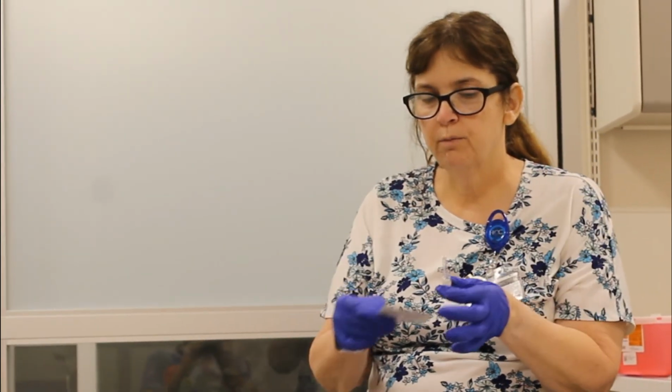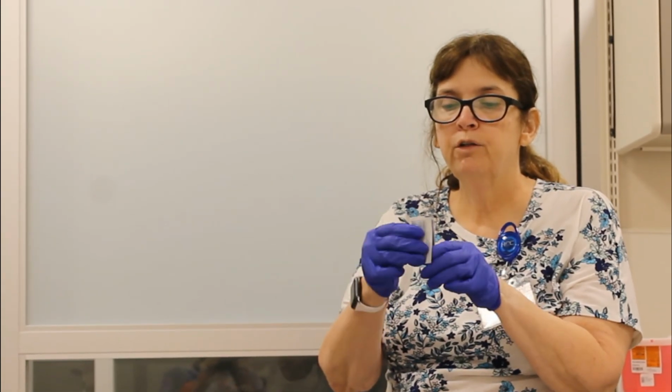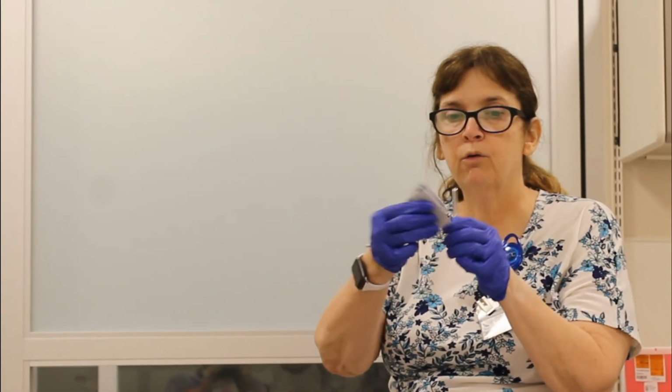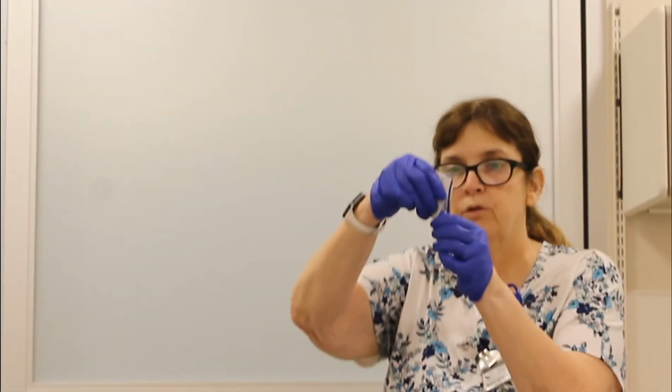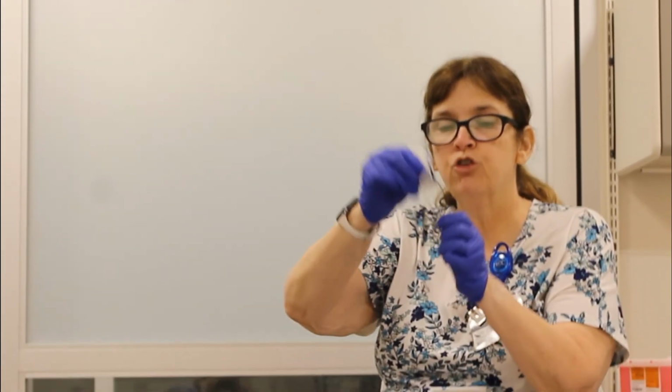All right, this medication that I'm going to show you is drawn out from an ampule. The reason I'm showing you this isn't related to our hyperkalemia patient, but just as a reminder, I know you learned it in first semester. First of all, this is a glass ampule. You want to break it using an ampule breaker, or you can wrap an alcohol wipe around it, hold the bottom tight, and then push it away from you. And you would put that in a sharps container.